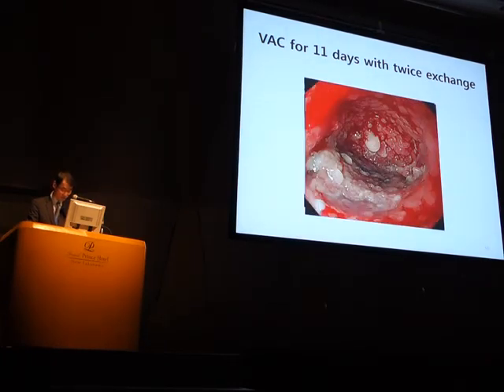11 days after treatment, significantly reduced cavity size with the development of granulation tissue inside was noticed and therapy was finished. The sponge was exchanged twice for effective drainage and stimulation of granulation tissue without adhesion between sponge and cavity during therapy.